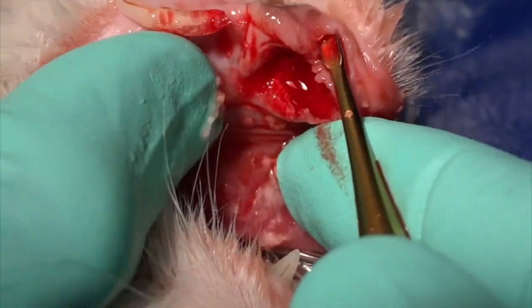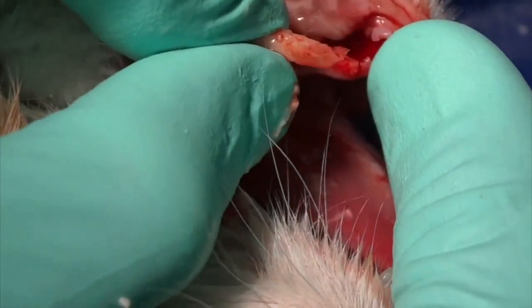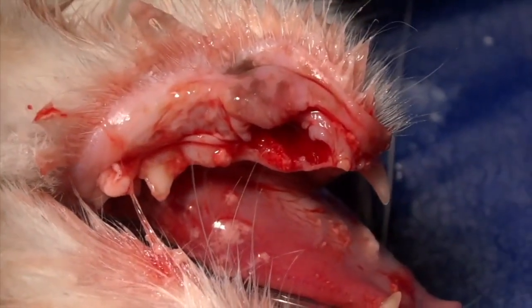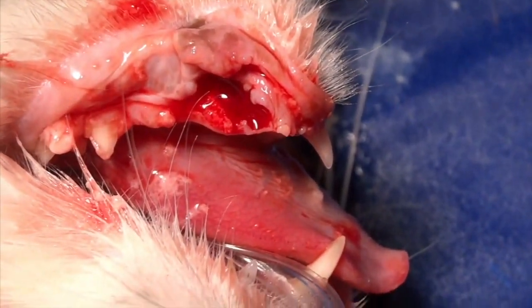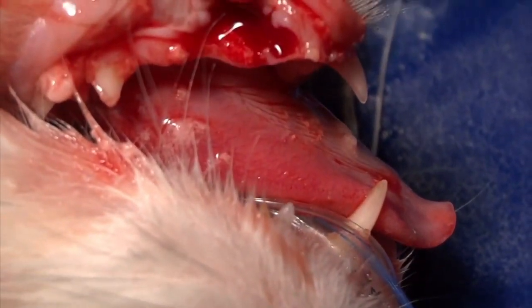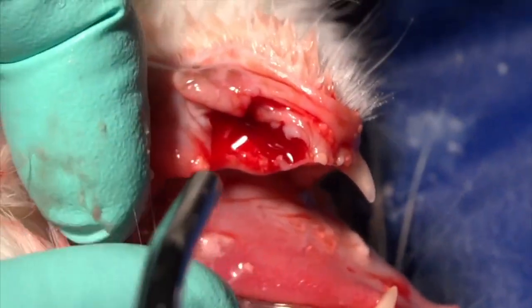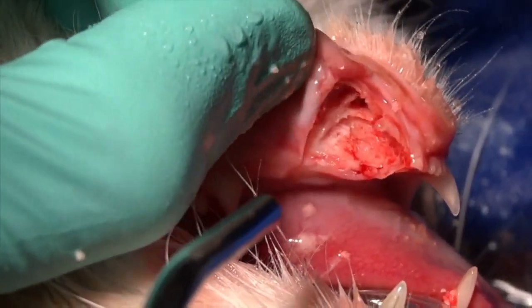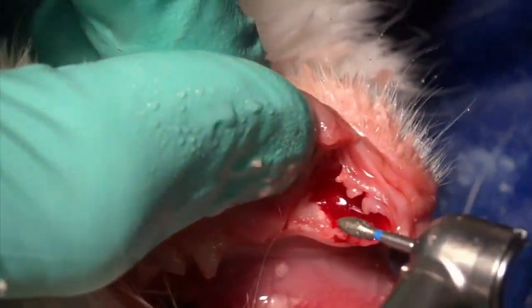You can see it just fractures right off at the area where the intersection is between the resorption and the tooth that's still fairly well formed in that coronal two-thirds. Again, it's not a crown amputation — I think that's a misused term. In our hands, it's more accurately described as partial extraction.